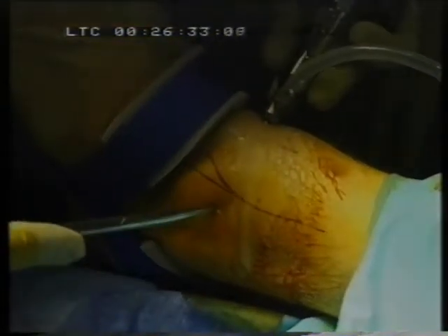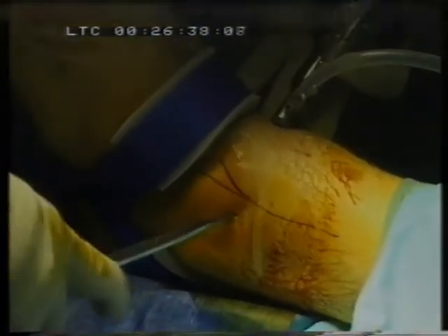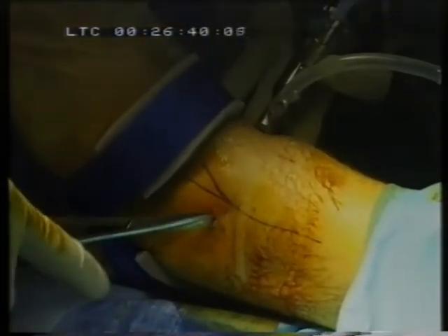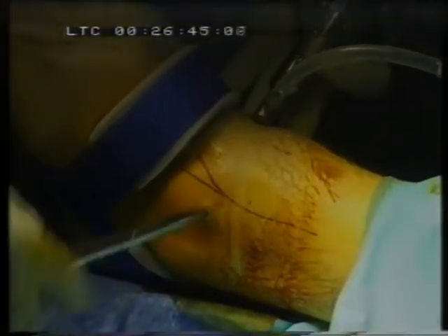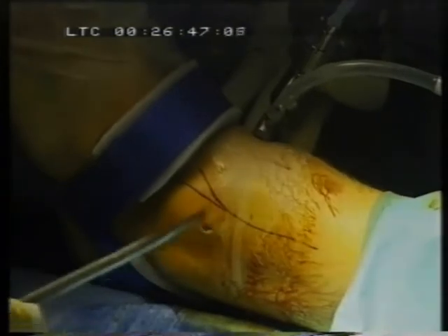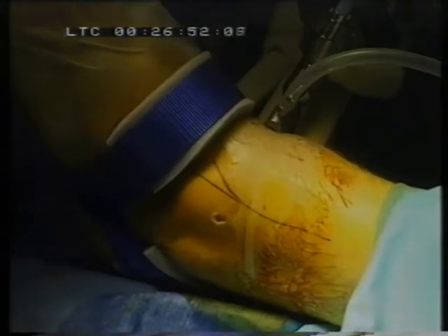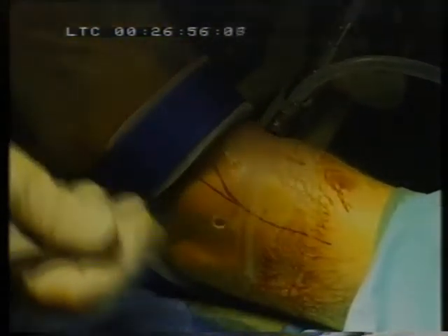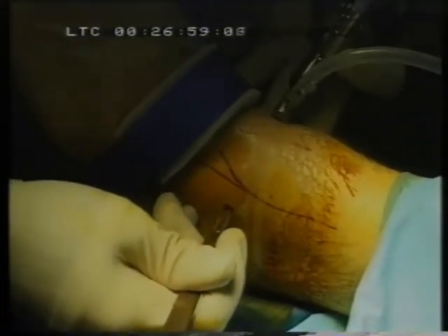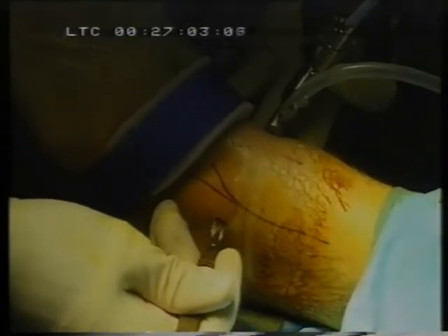If you come far lateral, I believe you've got less chance of getting the superficial peroneal nerve as it passes near this portal. And once again, just with the medial portal, push away. Once I get down to the joint line, to the joint capsule, I then complete a small capsulotomy using the blade through the area that I've blunt dissected through.